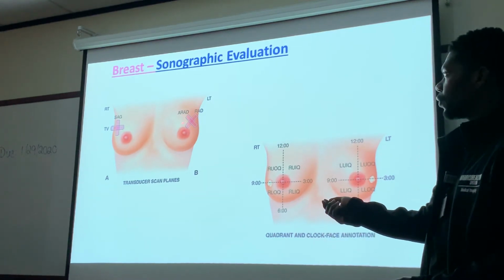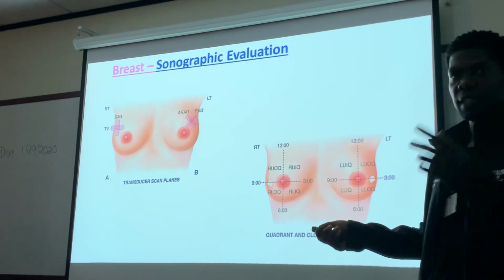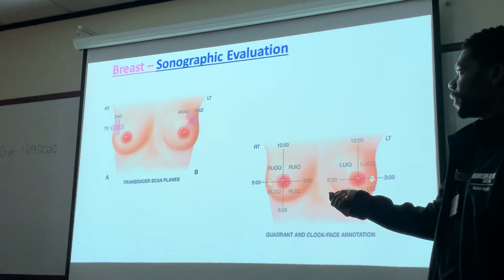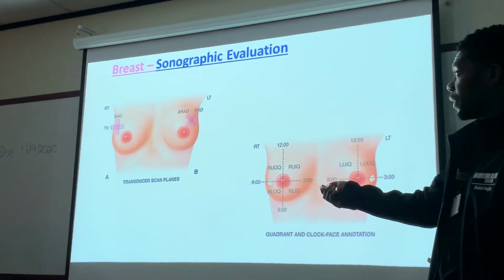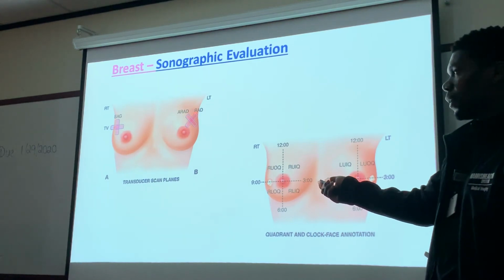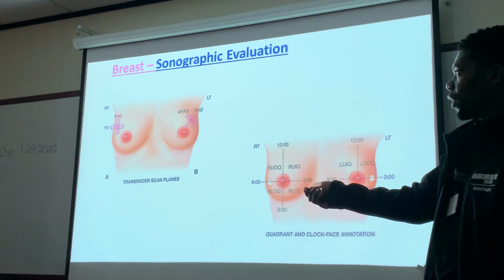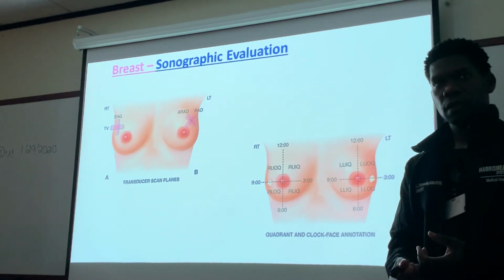When I'm at 12 o'clock, I'm still going to have my leading edge to the top, to the head. But when I get to 1 o'clock, in this radial position, my leading edge needs to be medial, right here, and my lateral edge on this side. On 12, it's leading edge up here. So you see what I mean by having to change that position?